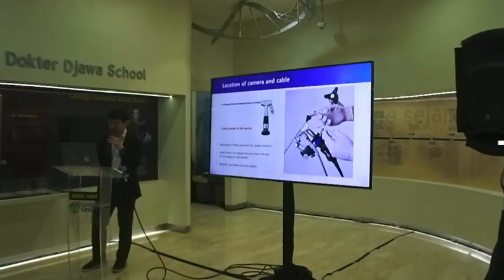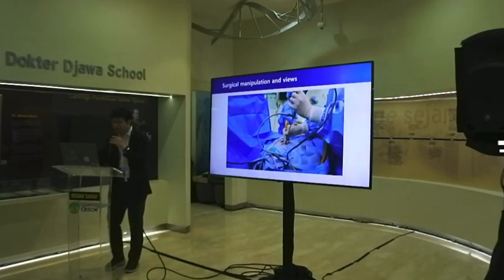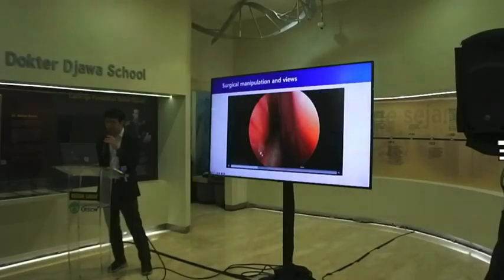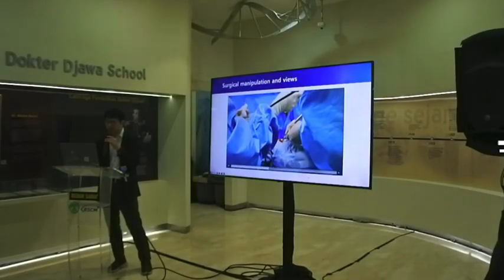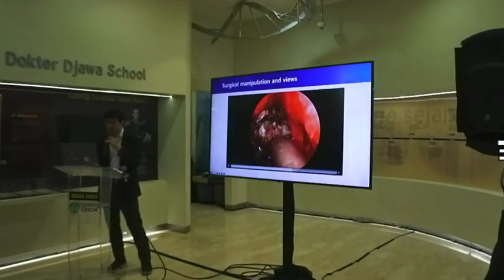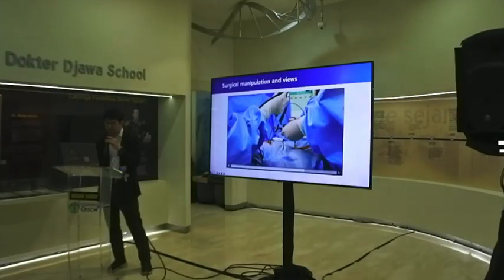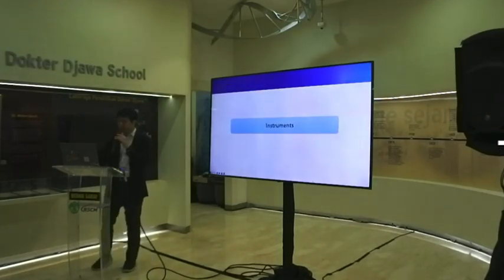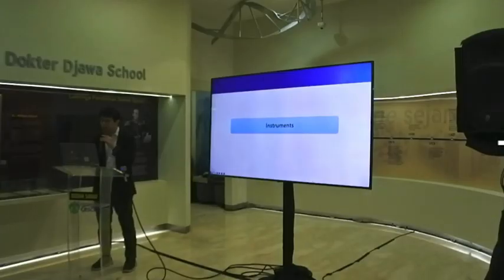There is a good surgical kit. And this is a visual example of the manipulation technique in practice, showing how the surgical hands and the instruments work together. Always make some space between the endoscope and the surgical hand. That's how to insert the bipolar. That's how to use the bipolar tips, and we have many surgical clips, so you can gain much experience through these lectures. And let's take a look at the specific instruments used in this type of surgery.